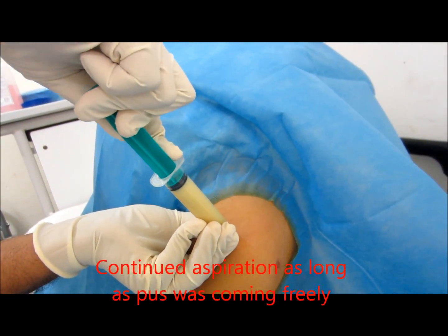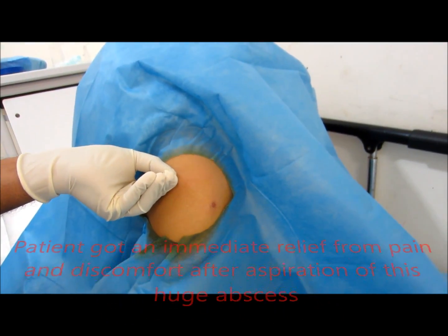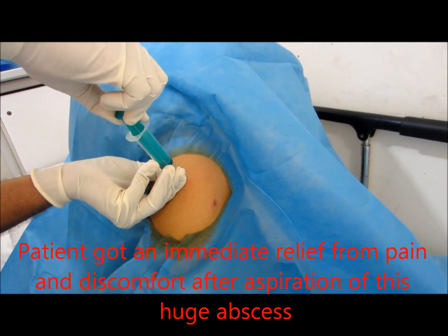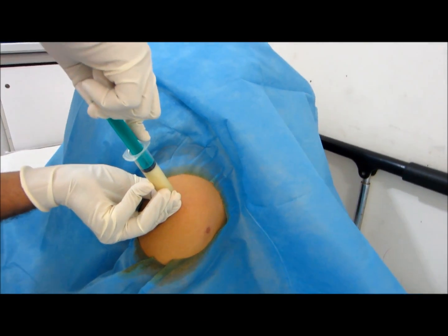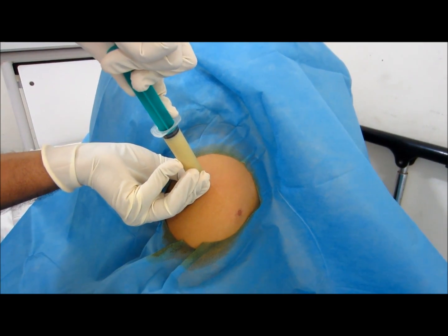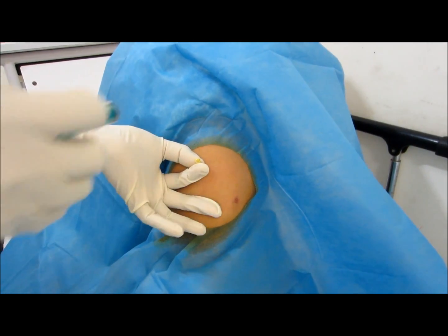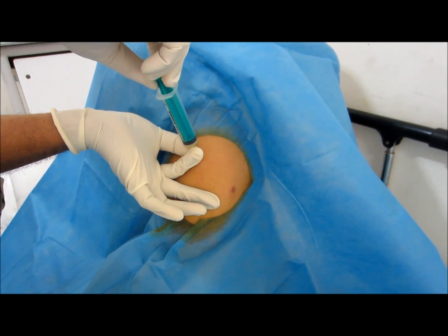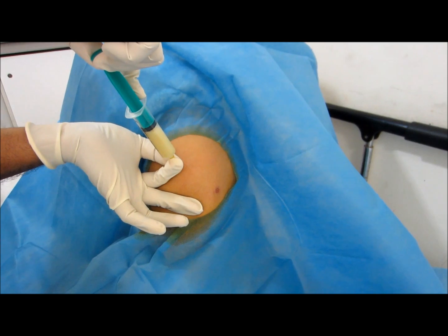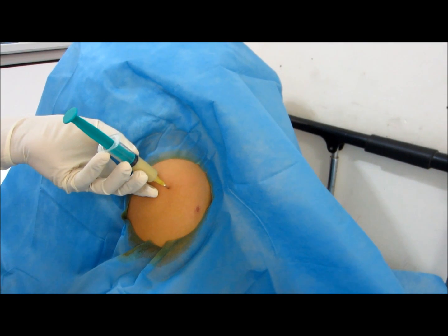Continued aspiration as long as pus was coming freely. The patient got immediate relief from pain, tension, and discomfort — a classic presentation of this huge abscess. One can see the size of the swelling has reduced significantly. The cavity is now almost completely emptied.